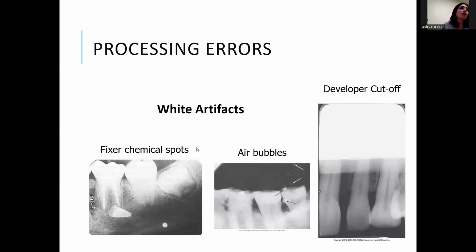Now with white artifacts, we have fixer chemical spots, air bubbles, and a developer cutoff. So it didn't get developed in this area, it only got fixed. And so that's why it's white.